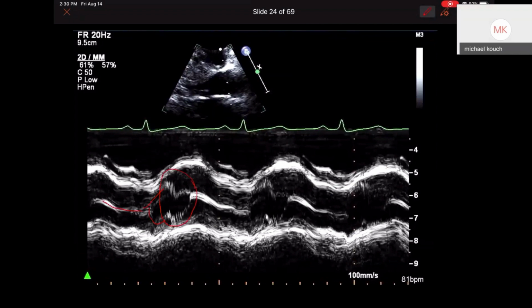So this is in the setting of hypertrophic cardiomyopathy as that valve starts to flutter and close earlier than it normally does. So there's earlier closing of your aortic valve leaflets. And we can see, again, another little tip that we look at during our board exams. We look at all of our images on the screen, and you can actually see your thickened septum right here, consistent with hypertrophic cardiomyopathy. And what might you see on your M mode structure?